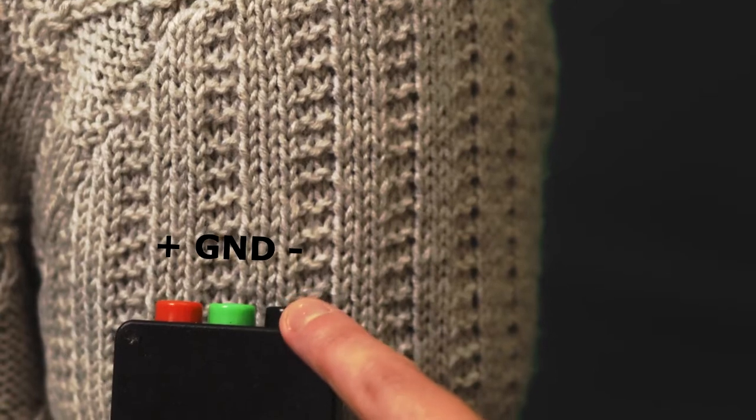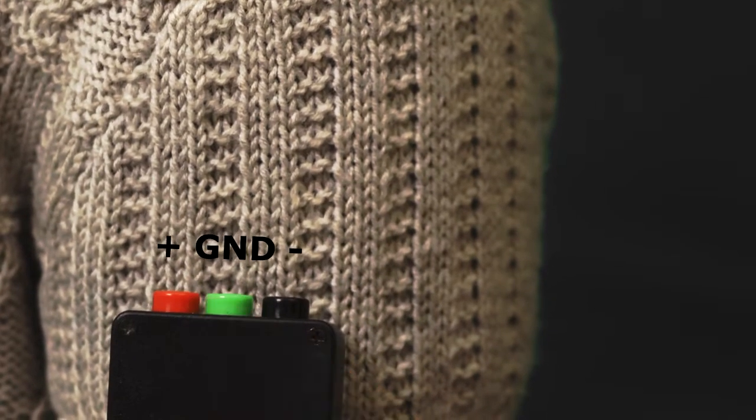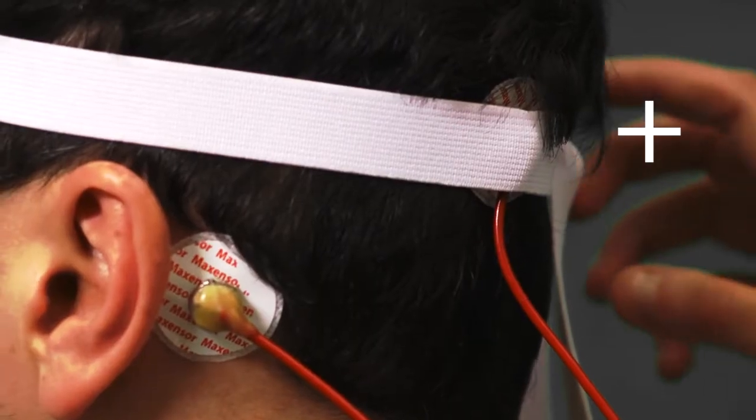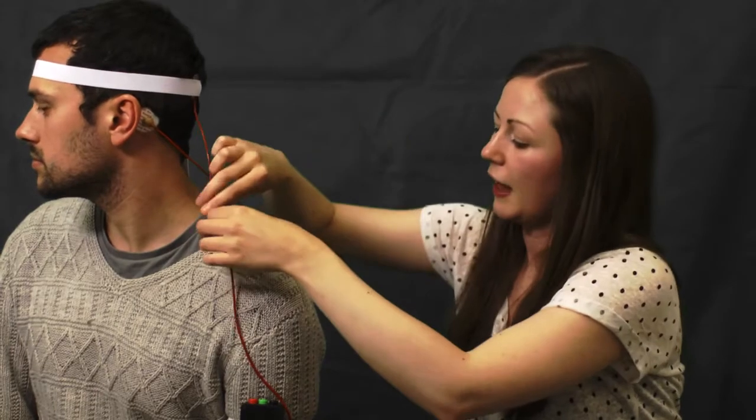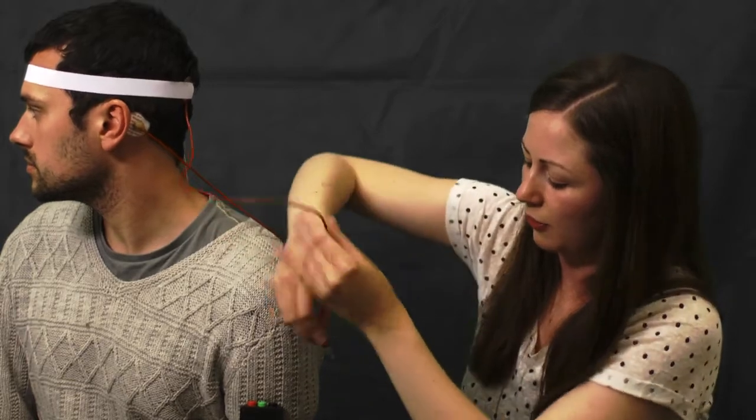Our amplifier has three different inputs: a positive, negative, and a ground. We're going to connect these to different areas of Jamie's head to record the EEG pattern. We'll start with our positive site, which is connected to the visual cortex. We're recording from Jamie's left-hand side. We already have the electrode in place, secured with this elastic bandage, and we're going to connect this to our positive.